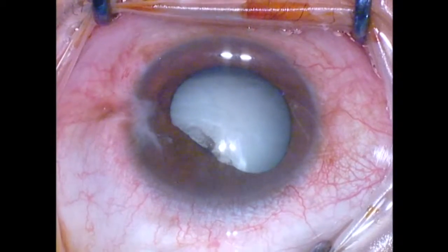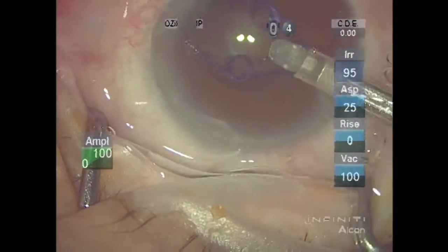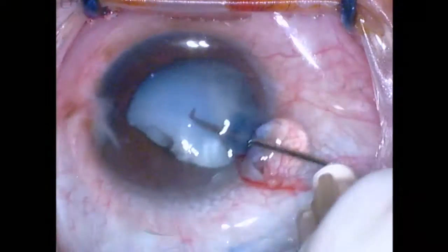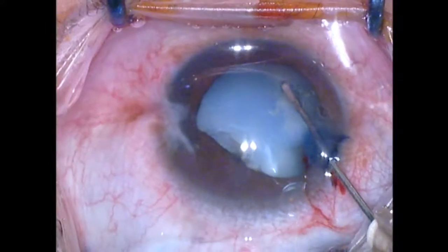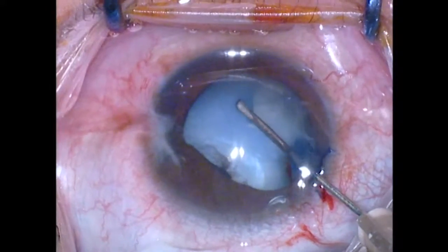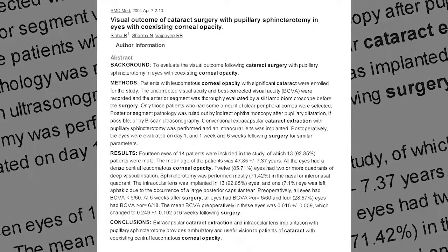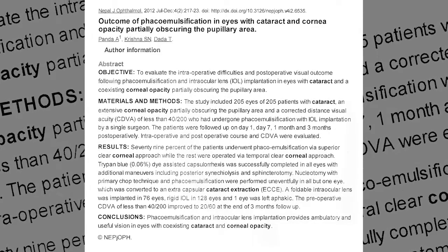Surgical technique is of paramount importance. Incision location could be utilized to lessen the astigmatism, depending on its severity, as well as the use of toric IOL. The application of the soft shell technique to protect the already compromised corneal endothelium, the use of external light source, enlarging the pupil or using capsular staining to get a better view are some of the strategies often used in these challenging cases. The literature, although scarce, also demonstrates good outcomes operating only the cataract in eyes with coexisting corneal opacities.